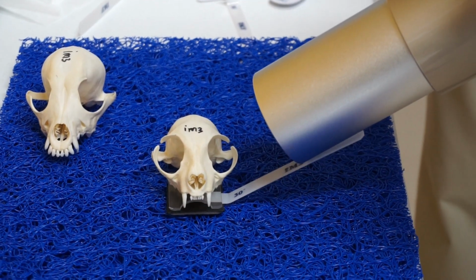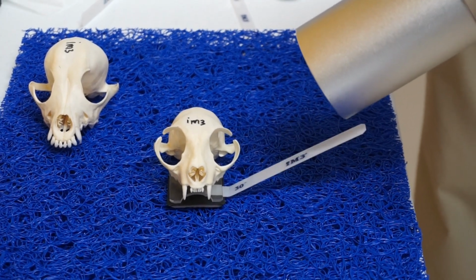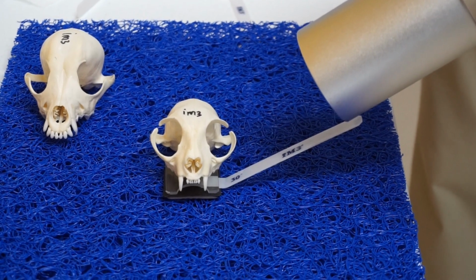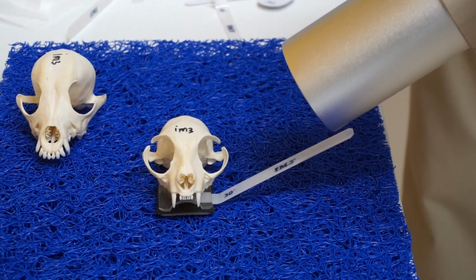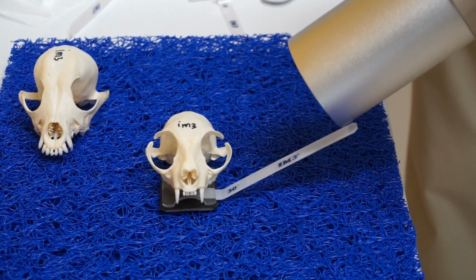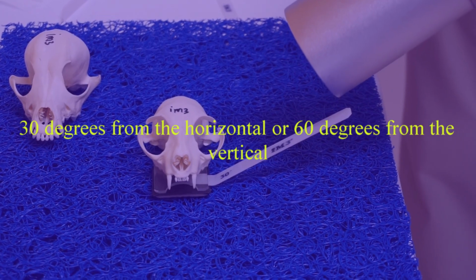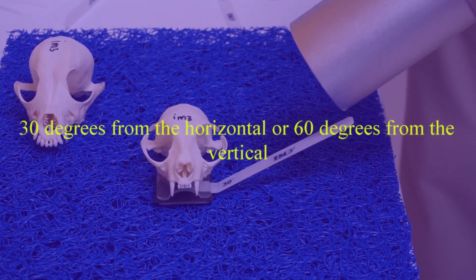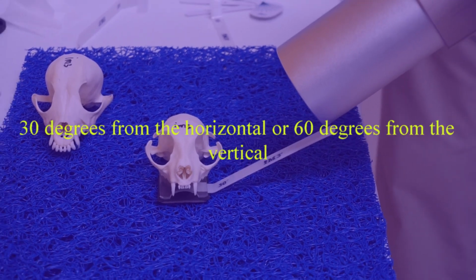By dropping it more horizontal, what that does is it moves the zygoma upwards or apically towards the end of the root of the tooth and allows you to visualize the cemento-enamel junction or the cervical area of the tooth. So just by dropping it to about 30 degrees with this little angle device, this positioning device, you can actually move the zygoma more apically so that you can now visualize the cervical area of the tooth.